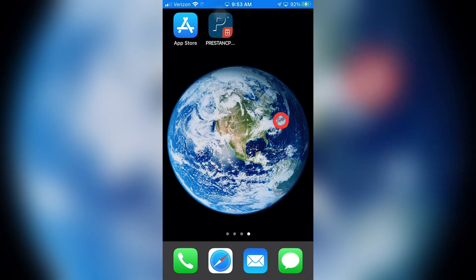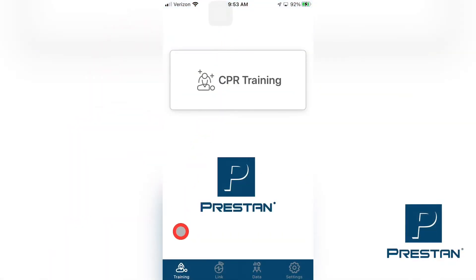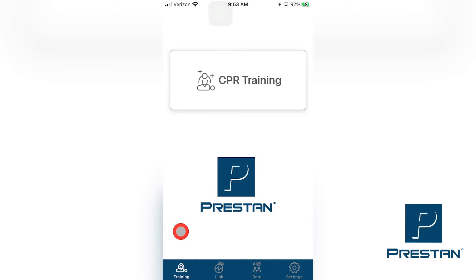The Preston CPR Feedback App contains a number of tabs at the bottom of the screen that can be used to manage and control the device and the data. These include the training tab, the link tab, the data tab, and the settings tab.